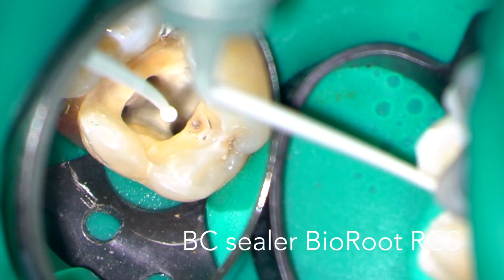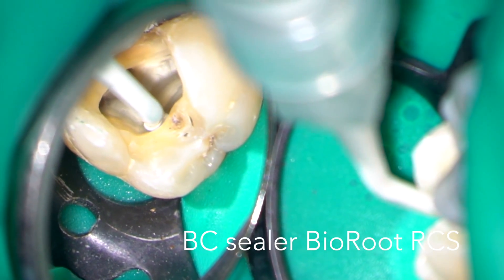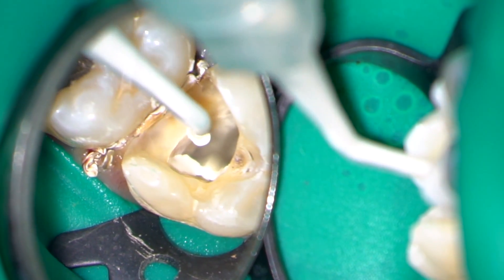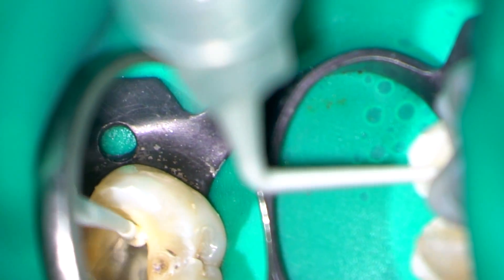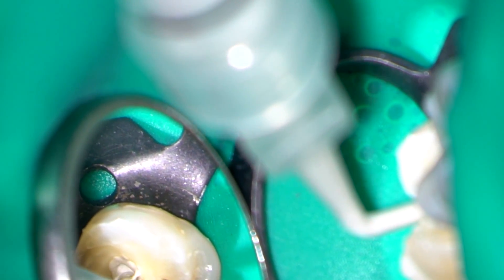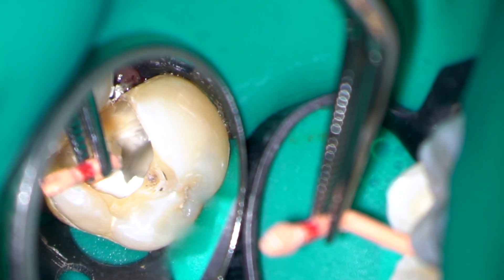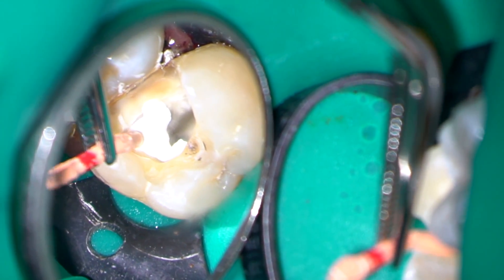In this case I'm going to use a very simple single cone and bioceramic sealer technique to obturate the root canals. I used BioRoot RCS and I like to inject the material into the coronal part of the root canals before placing the GP cone, as I've found this to be less messy. The pre-measured master cones are then inserted through the sealer to the full working length, seared at the level of the pulp floor and plugged with a Mach 2 plugger.